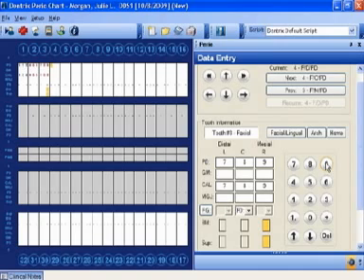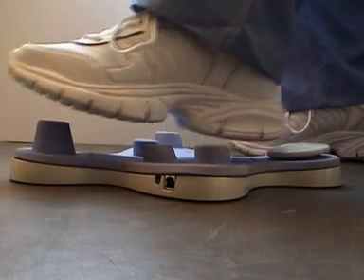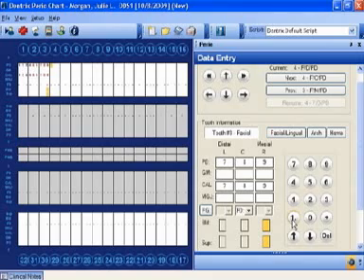If you had a 10 or higher, you would do this 1 dot. You'd just take the mouse over with your toe to the 1 dot and heel click. And then it's waiting for your second number. So if it's a 10, you're going to add your 0 and you're going to heel click again.